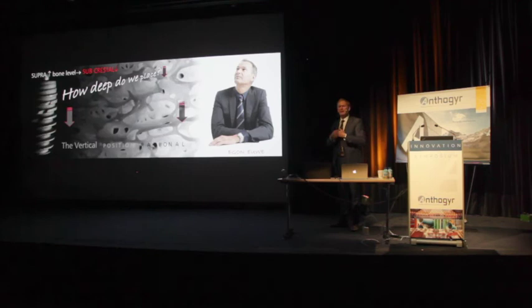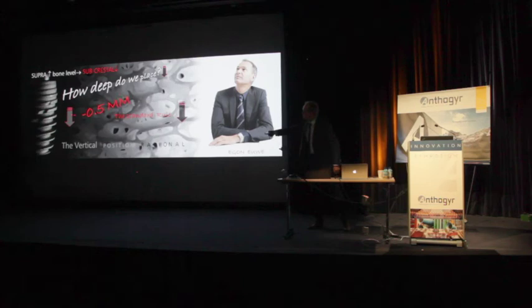Everybody in this room should have a clear idea. And we already agreed, place it a little bit deeper. If we go by the book, it says go 0.5 below the bone level. Now, is this really true? I think we should know one more thing. We should not look too much at the bone.